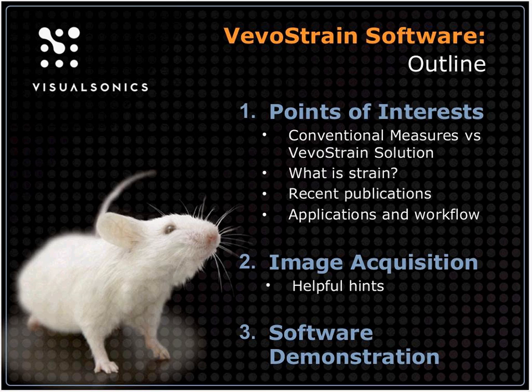In the next portion of the presentation, I will touch on image acquisition, so just a few pointers or tips to help you acquire an image that will help you use the software. And then finally, I will go through the software demonstration.